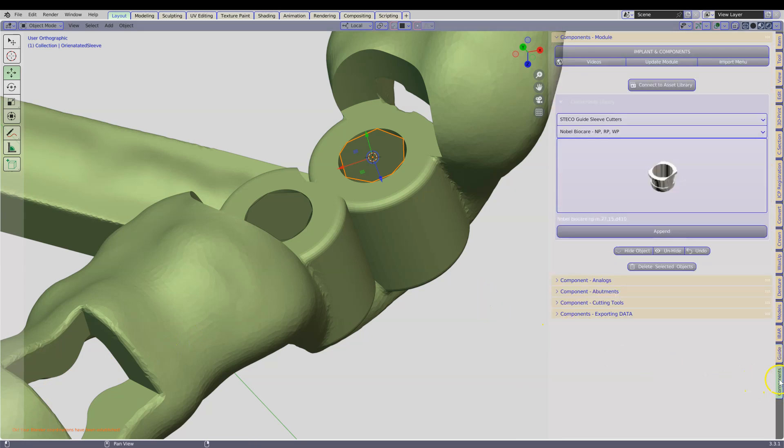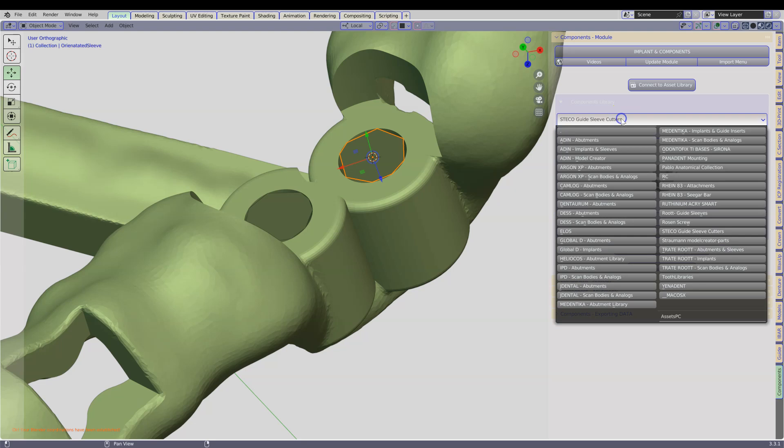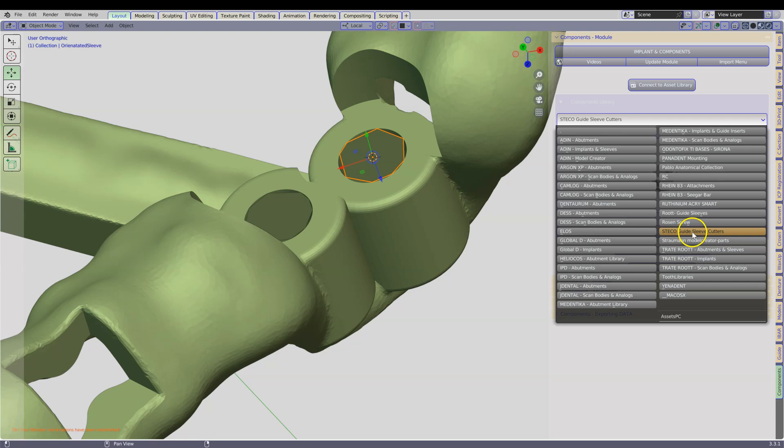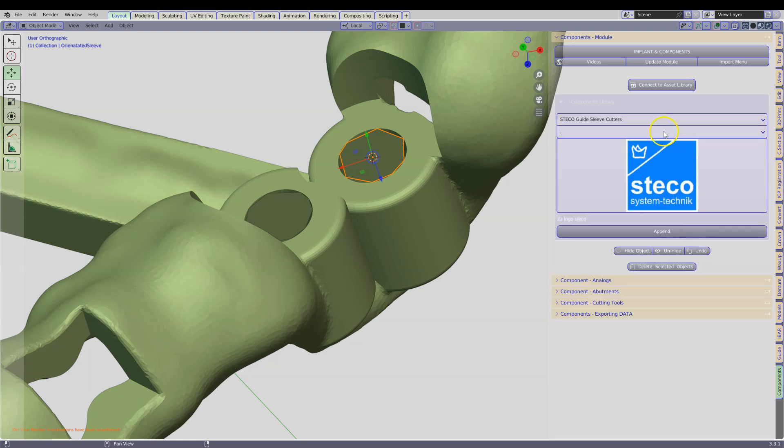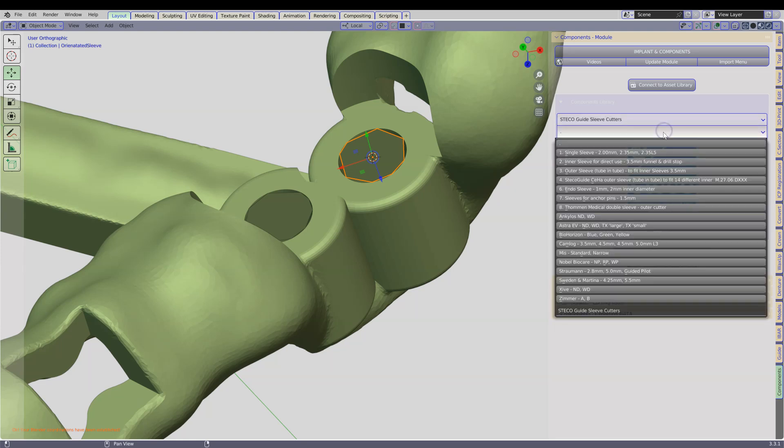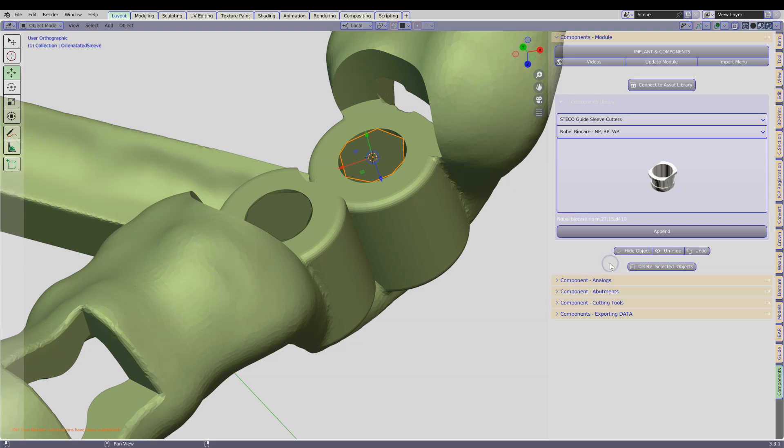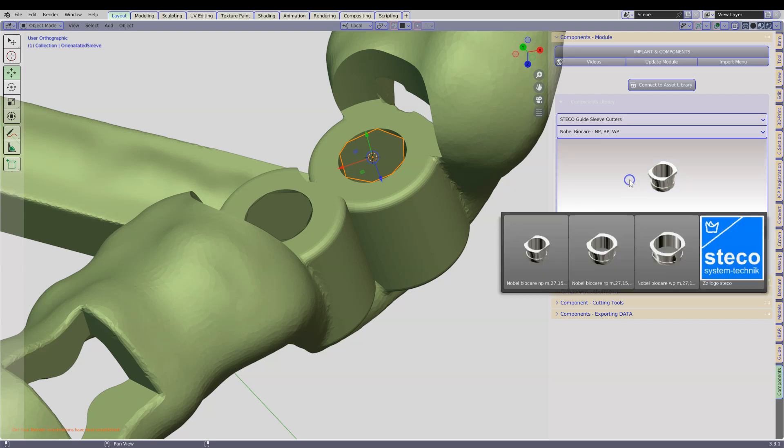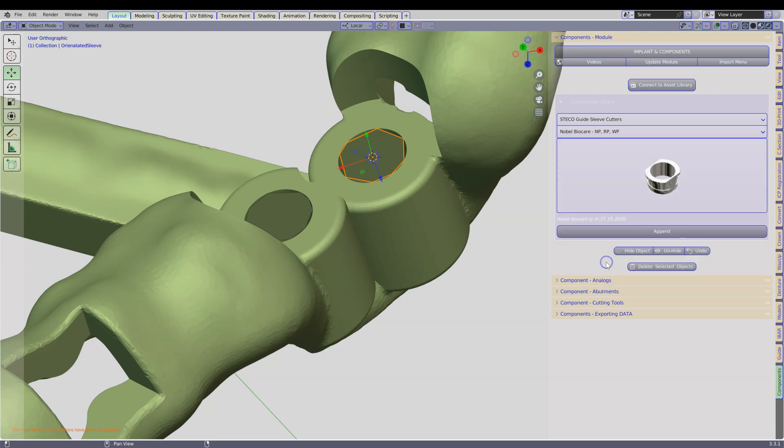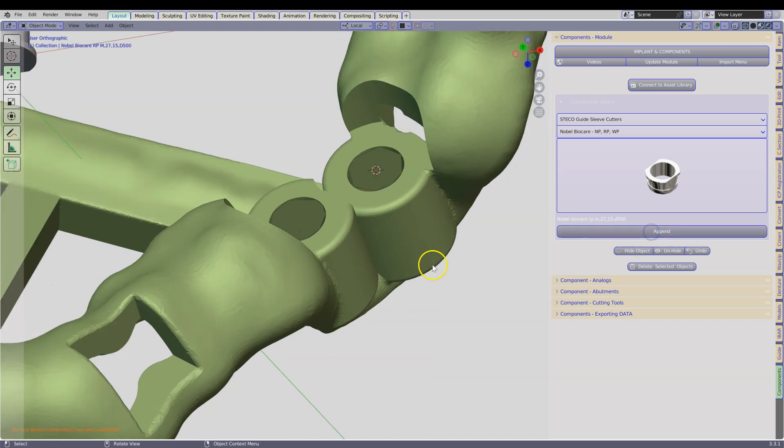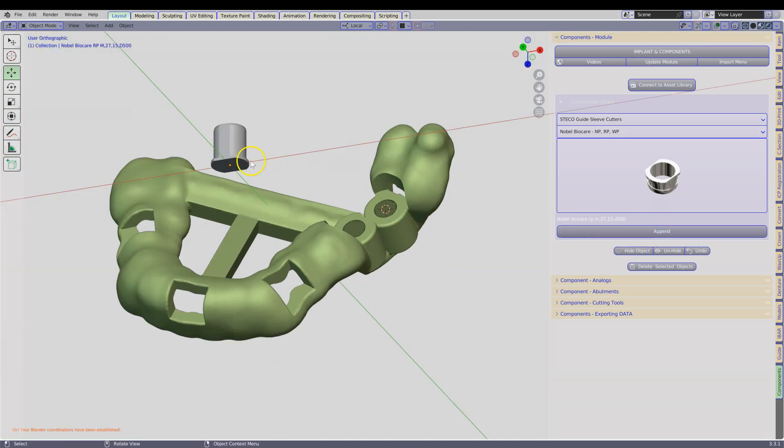Go to your components module and look for the cutter that you need for the metal insert. In this case Stecco, we are going to go to the Noble Bio Care and we are going to choose the regular platform.